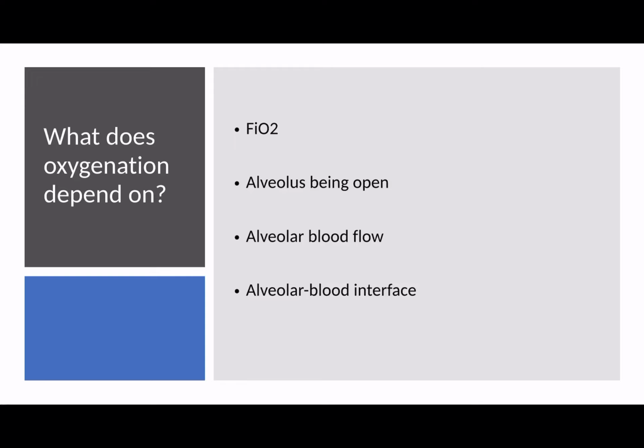Now, a very simple method of this, which you might see with non-invasive ventilation, is something called CPAP, continuous positive airway pressure. And essentially what this is akin to is you driving in your car and sticking your head out of the window. Suddenly you'll get a rush of air and you'll get the lungs expanding up that little bit more. You're still breathing on top, but your lungs just expand up, and that's exactly what PEEP is. Trying to open up as many alveolar units as possible.